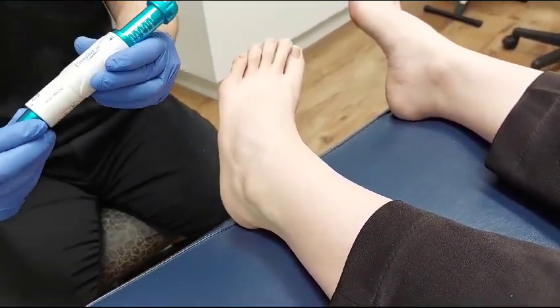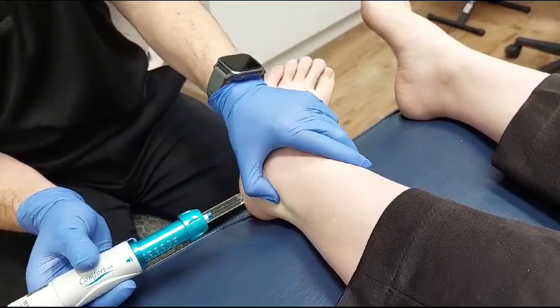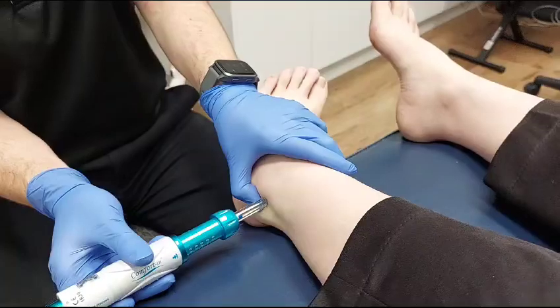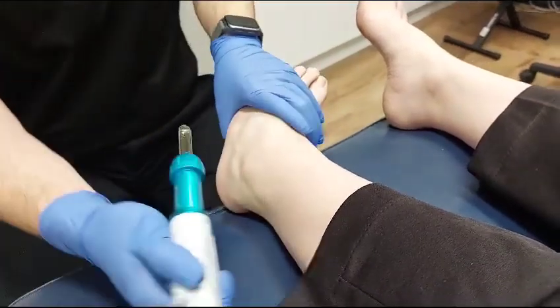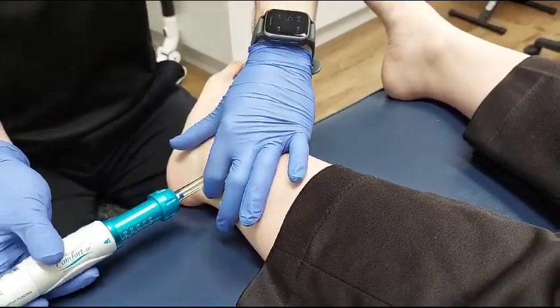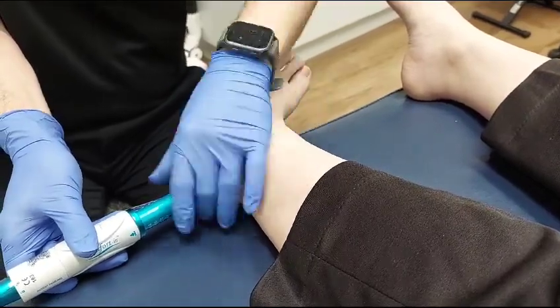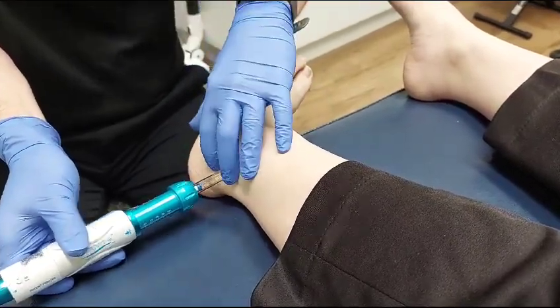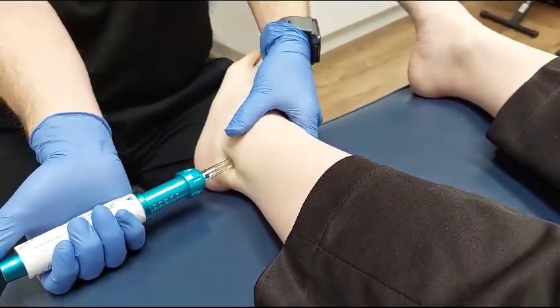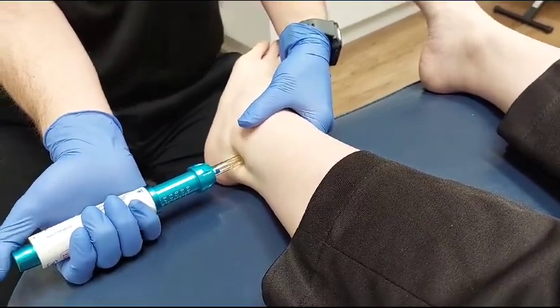Have a look, unlock, avoid the depressor, and then what you need to do is get the foot into the right position. Find your spot — might just get you to rotate a little bit more that way. Relax your ankle. Some good skin tension there. And there we are, in position — just a little bit further down there.